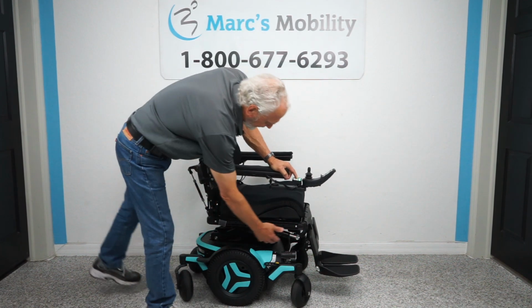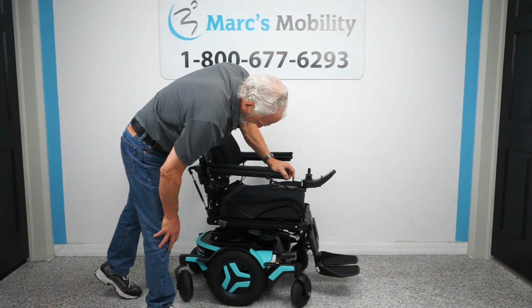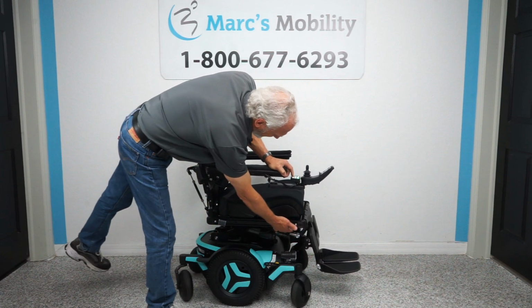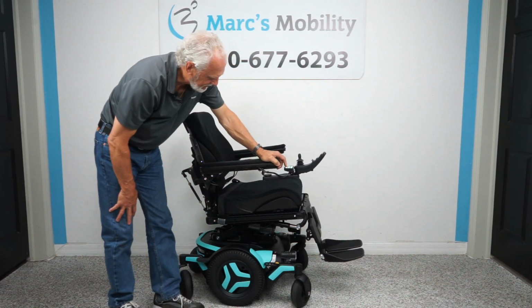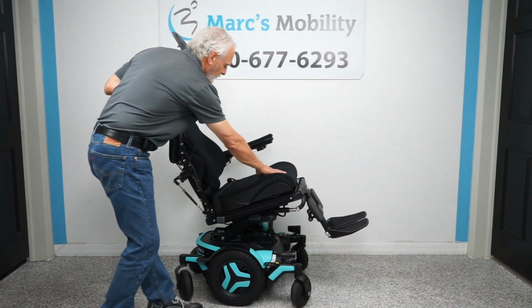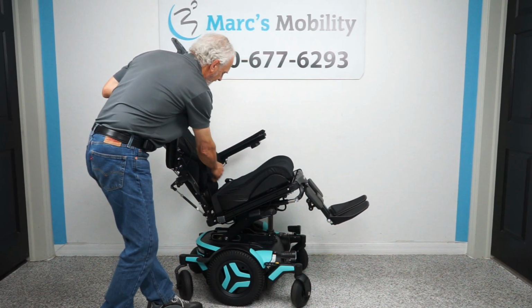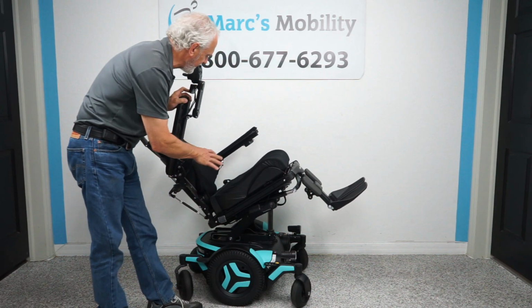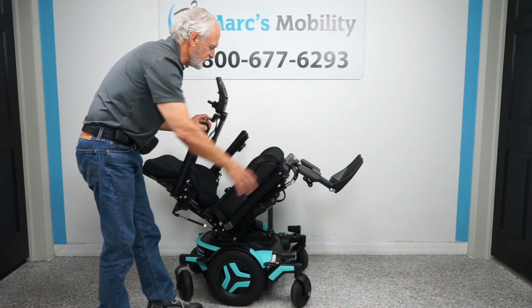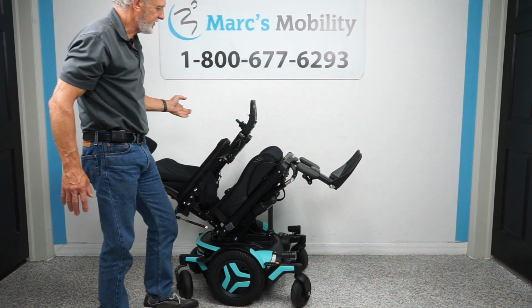And now we're going to do the tilt. The tilt, let me bring it back down. The tilt will be when the front right here goes back. Now we're going backward. This is called the tilt. This is good if you want to relieve pressure off your bottom, pressure off your back. There's a lot of good medical benefits on this. Or if you just want to relax, or you want to have some circulation in your legs. This is called the electric tilt.